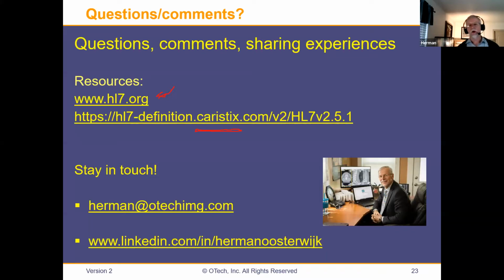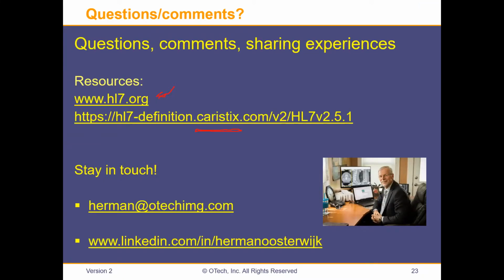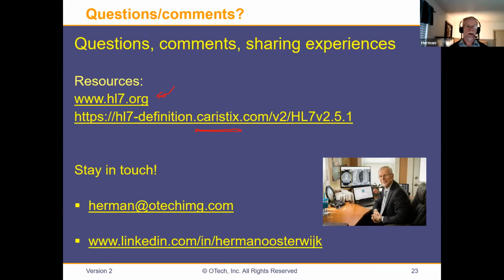One that is a little bit more complex and a little bit harder to install is DCM4CHE, right? DCM4CHE is a kind of sophisticated, big open source PACS system, but a very nice worklist provider. As a matter of fact, I know some people that use it in a kind of semi-production environment or as a test PACS. So if I want to do some more sophisticated testing, I use the DCM4CHE modality worklist provider.